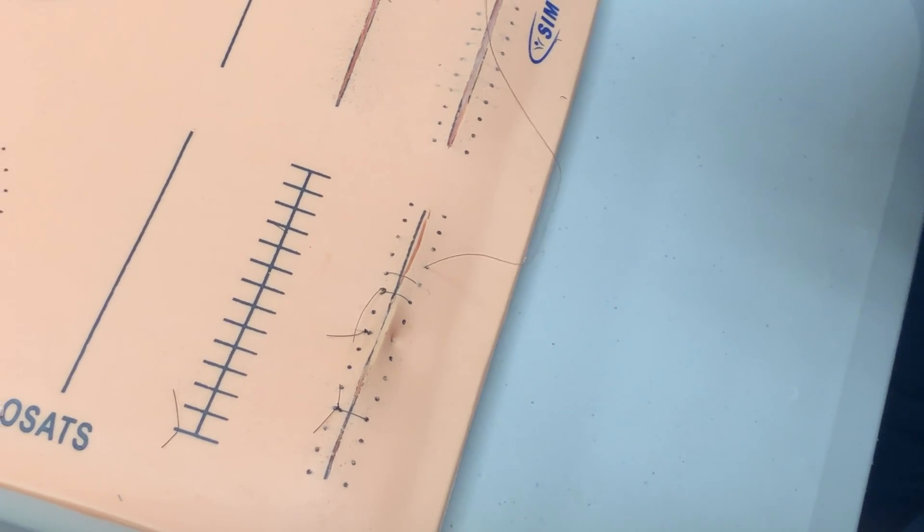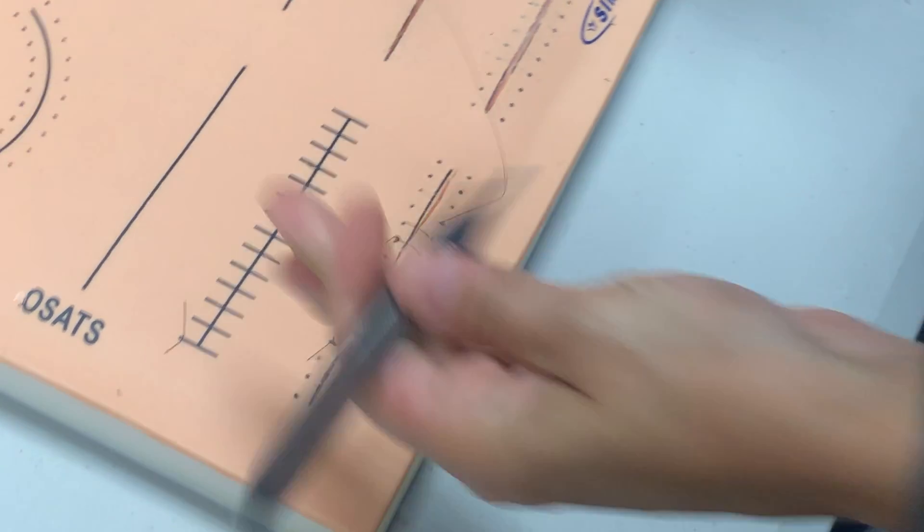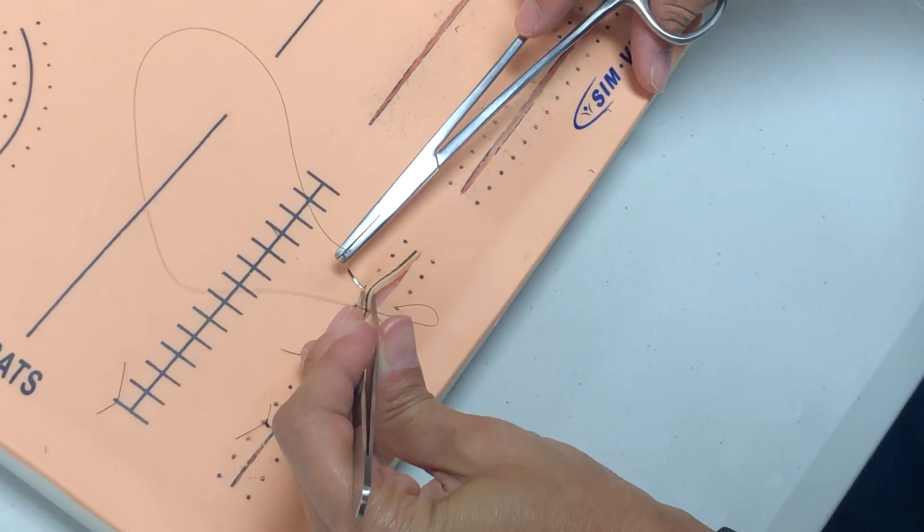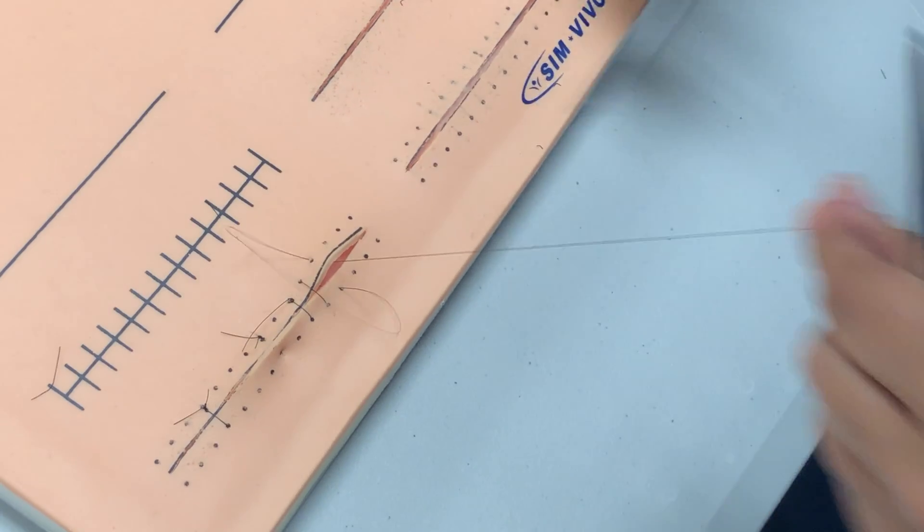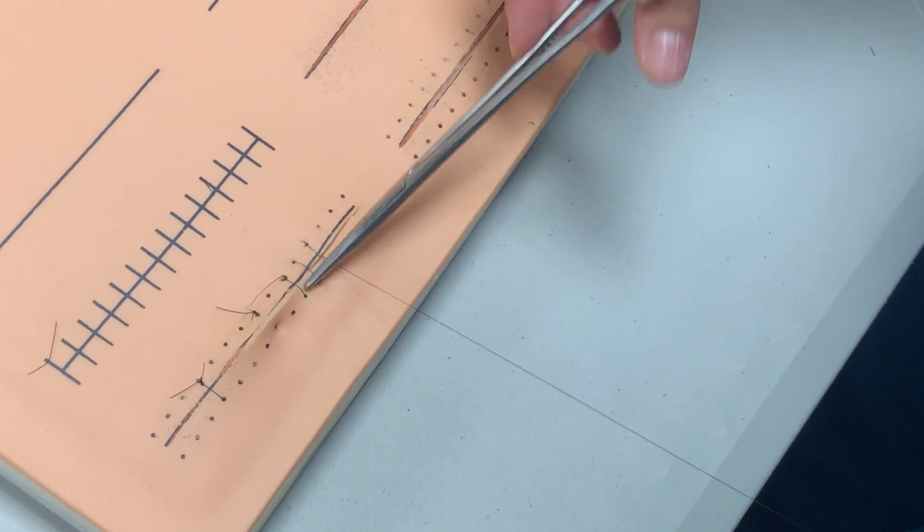Kind of make sure that everything's laying flat as I go. This one goes across. Just making sure it kind of lays flat.